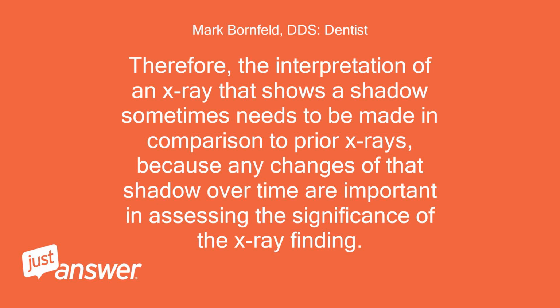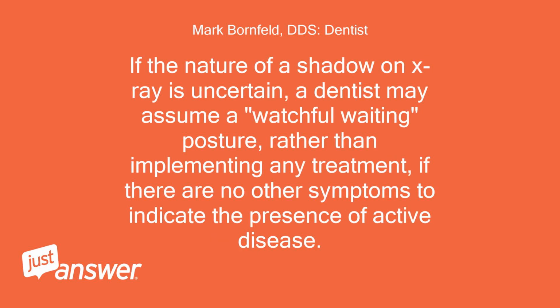Therefore, the interpretation of an X-ray that shows a shadow sometimes needs to be made in comparison to prior X-rays, because any changes of that shadow over time are important in assessing the significance of the X-ray finding. If the nature of a shadow on X-ray is uncertain, a dentist may assume a watchful waiting posture, rather than implementing any treatment, if there are no other symptoms to indicate the presence of active disease.